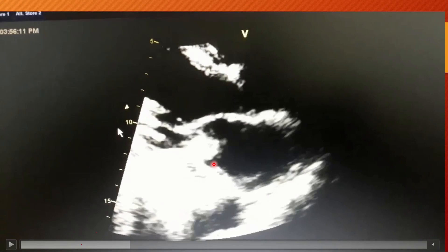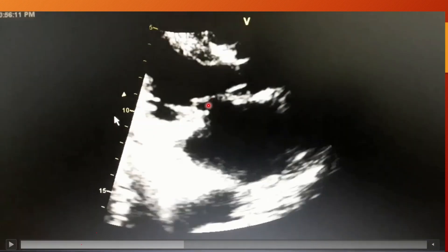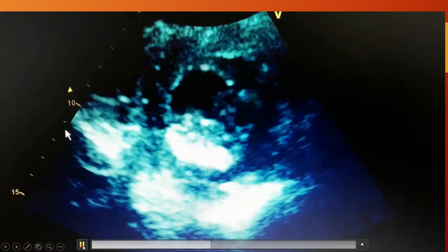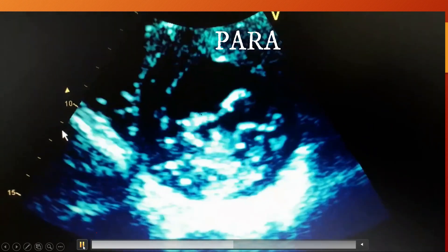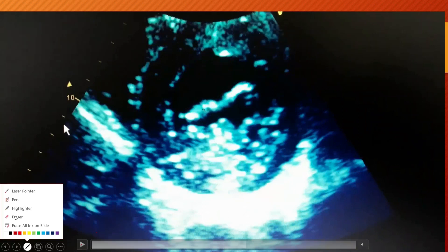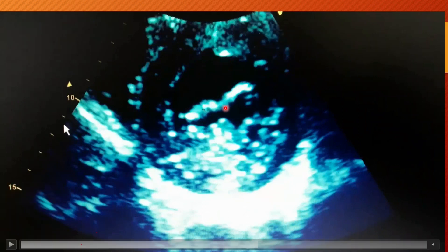While this is the mitral valve between the LV and left atrium. This is the zoomed-in view of the parasternal long axis view in which we have zoomed in on the mitral valve — this is the anterior mitral leaflet while this is the posterior mitral leaflet. Next we have the parasternal short axis view at the mitral valve level, where you can again see the anterior mitral leaflet and the posterior mitral leaflet.